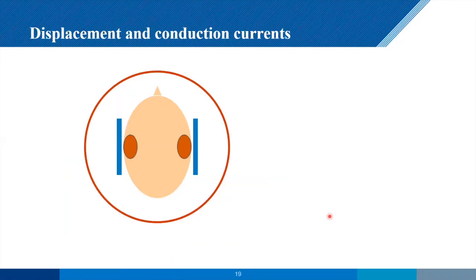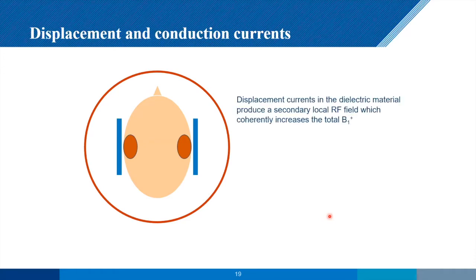And then the theory behind this, of course, is that in a high permittivity material, it has displacement and conduction currents. So displacement currents are what we want. In other words, the electric field that is produced by the birdcage coil over here is going to interact with a high permittivity material. That creates a secondary magnetic field. And if that secondary magnetic field can fill in the space here, the dark areas in the temporal lobe, then we're going to get towards a more homogeneous and more uniform contrast.